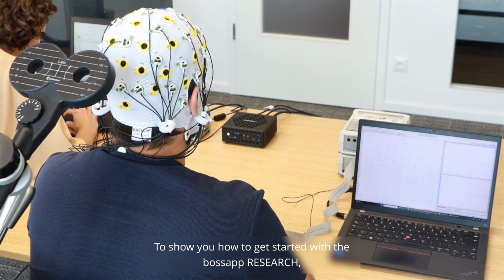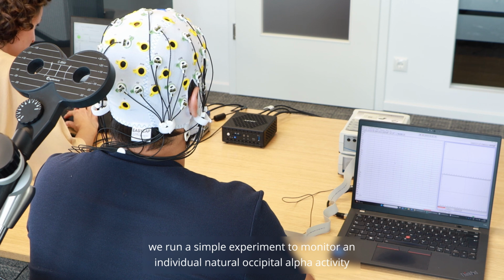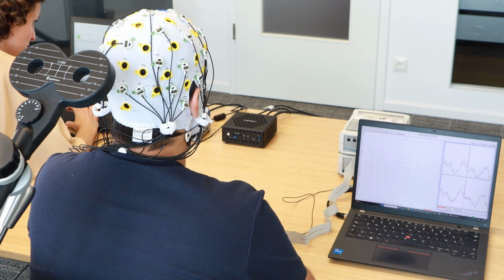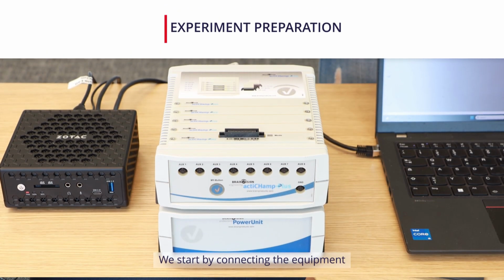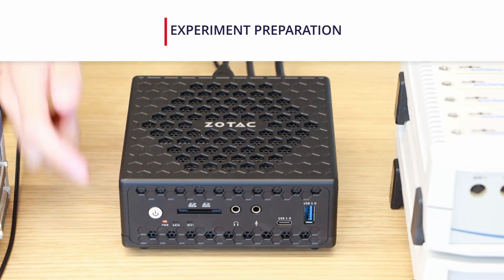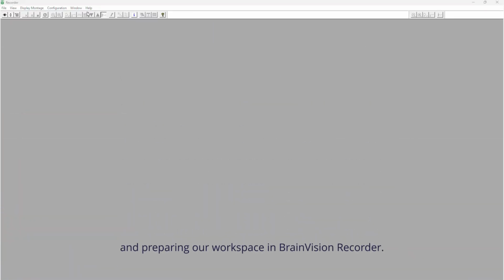To show you how to get started with the bossapp research, we run a simple experiment to monitor an individual natural occipital alpha activity during resting state with eyes closed and target the moments of peak phase. We start by connecting the equipment. And preparing our workspace in BrainVision Recorder.